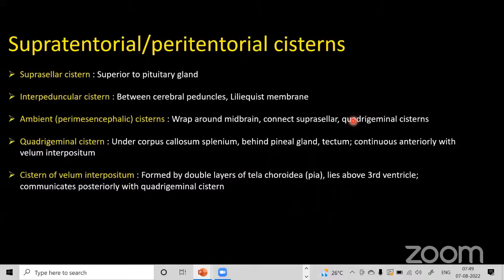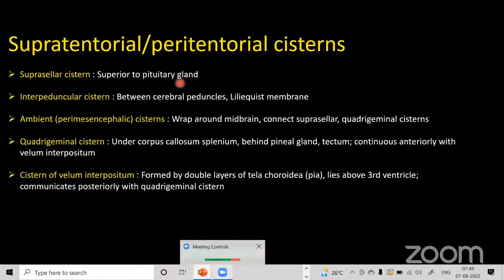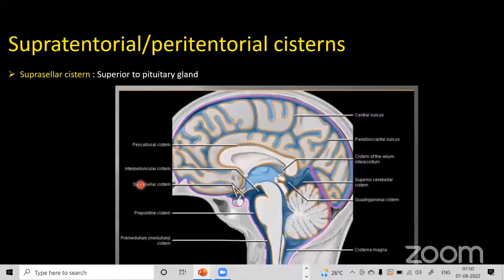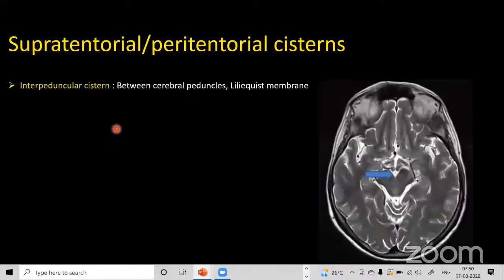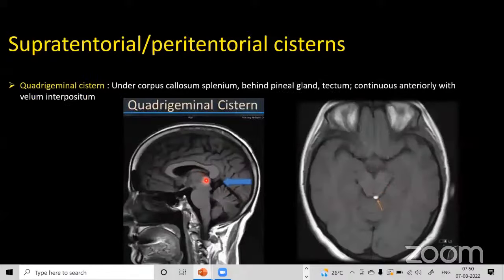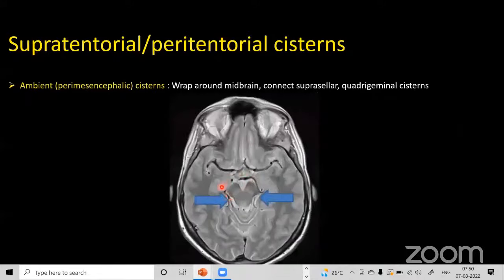The cisterns can be divided into supratentorial, infratentorial, and lateral systems. The important supratentorial ones are the suprasellar cistern (superior to the pituitary gland), interpeduncular cistern, ambient cistern, and quadrigeminal cistern — which lies under the corpus callosum splenium, behind the pineal gland, and is continuous anteriorly with the velum interpositum cistern. The perimesencephalic group includes the interpeduncular, crural, ambient, and quadrigeminal cisterns — with interpeduncular and quadrigeminal being midline unpaired, and crural and ambient being paired.